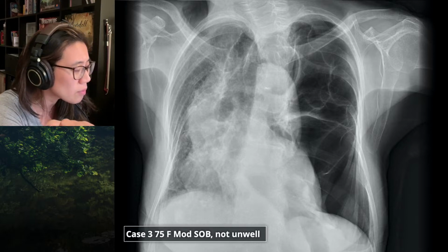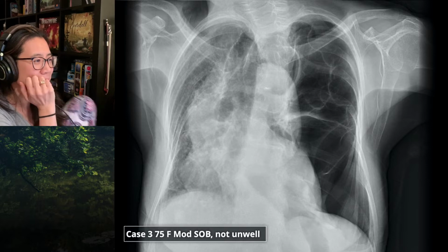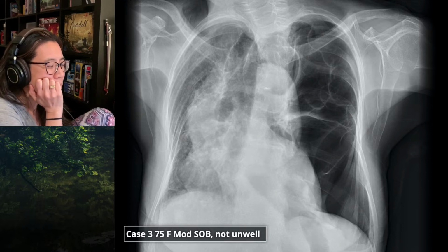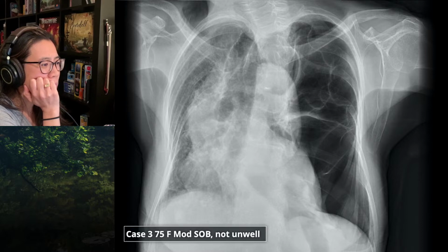Right. She's never had a previous X-ray. She's never been to the hospital before. But what you've just done, can I just point out to the registrars, is what you have to do. When you've got doubt in your mind, you have to mention both possibilities. Too many people try and punt on one and guess and go down the gurgler. You're exactly right. Is this dud lung, big bullous emphysema, unilateral, or is it a bizarre pneumothorax?